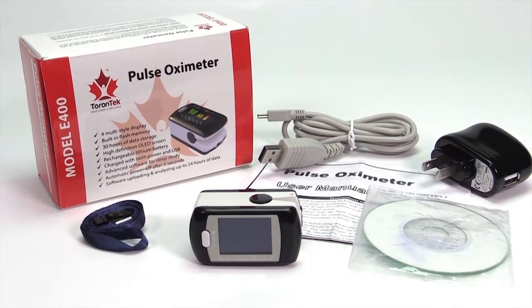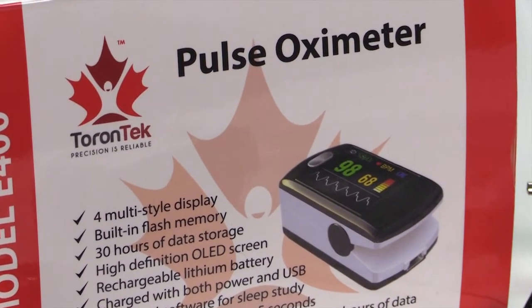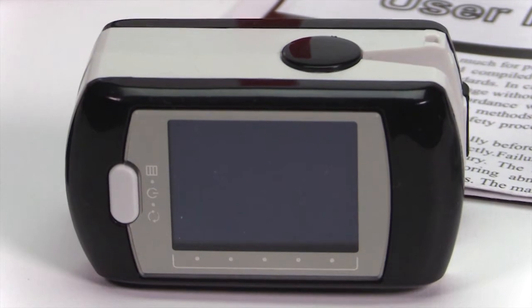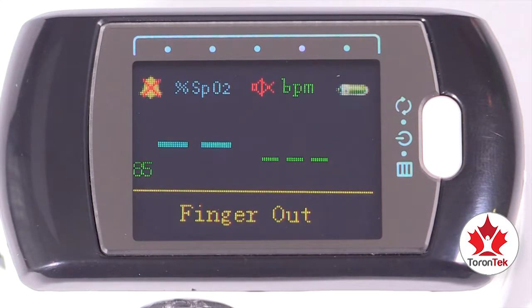With the Torrentech E400 pulse oximeter, you can keep track of your oxygen blood levels over time. This device has a very user-friendly interface. Turn on the device by pressing the on button for three seconds. The screen will show information about the system.